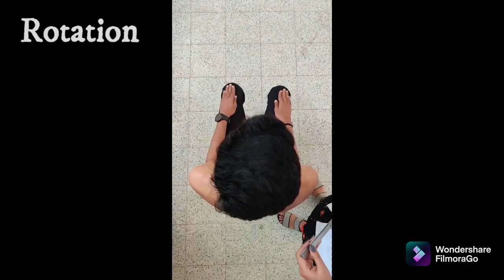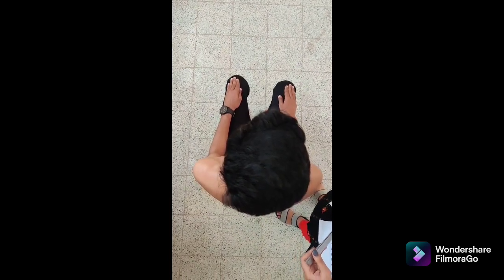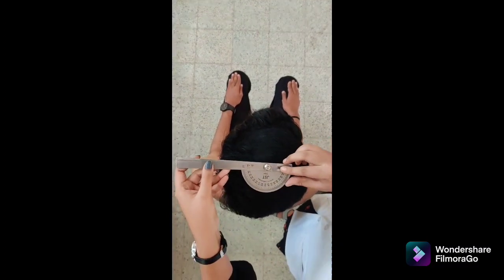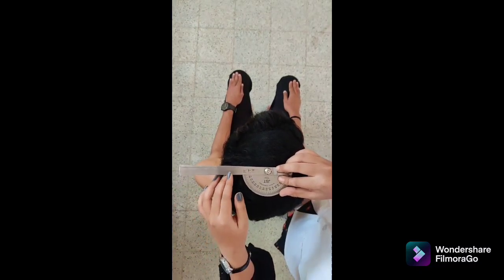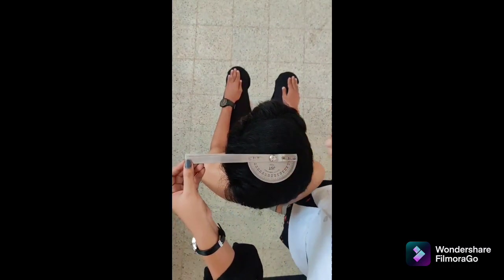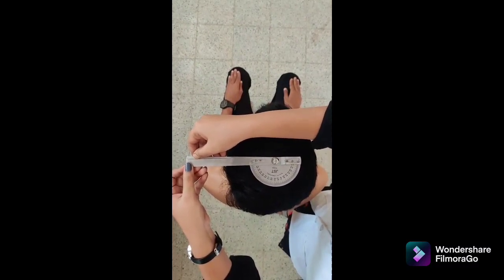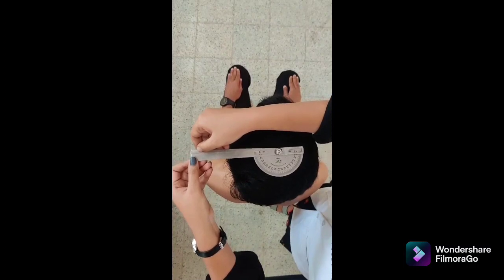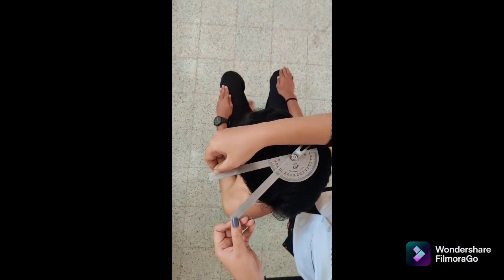We are going to perform thoracolumbar rotation with universal goniometer. Patient position: sit on a chair without a back support. Goniometer alignment: fulcrum over the center of the cranial aspect of the subject's head, movable arm parallel to an imaginary line between the two acromial processes, stable arm aligned with the movable arm. Instruction: turn the body to one side as far as possible while keeping the trunk straight and feet flat on the floor. The movable arm moves with the patient. Normal range: 0 to 45 degrees.